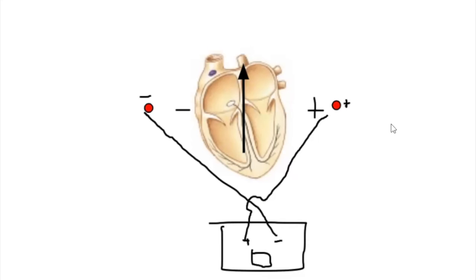Okay, so we need some intuition of the vertical component. And so like he said, we could get away with 3 electrodes, right? Because we could put 2 on the horizontal, and then we could put 1 on the vertical, and that would give us reference points. But the math is a little bit more complicated; it's less intuitive. So let's just work with 4 for now. Here are my annotations.